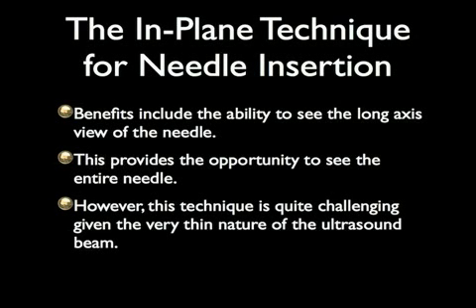The in-plane needle insertion technique has the benefit that the operator has the ability to see the long axis view of the needle. This provides the distinct opportunity to see the entire needle. However, this technique is quite challenging given the very thin nature of the ultrasound beam and the subsequent ergonomic challenges of continuously imaging the needle.